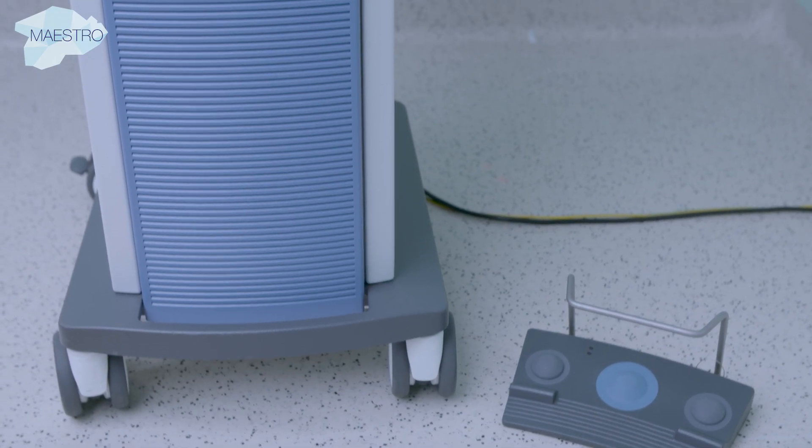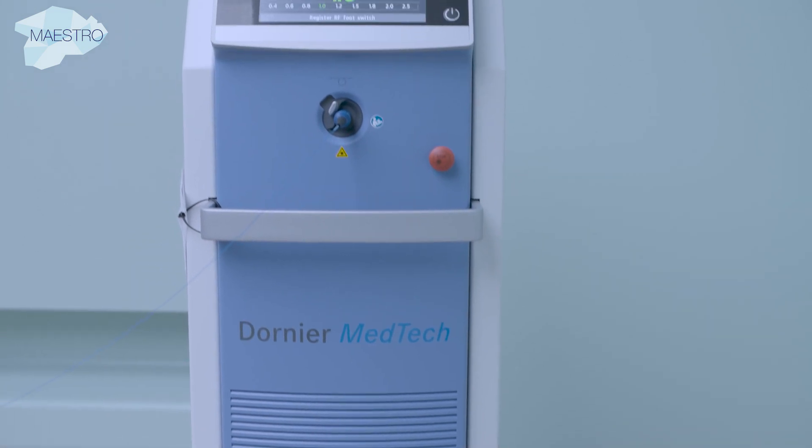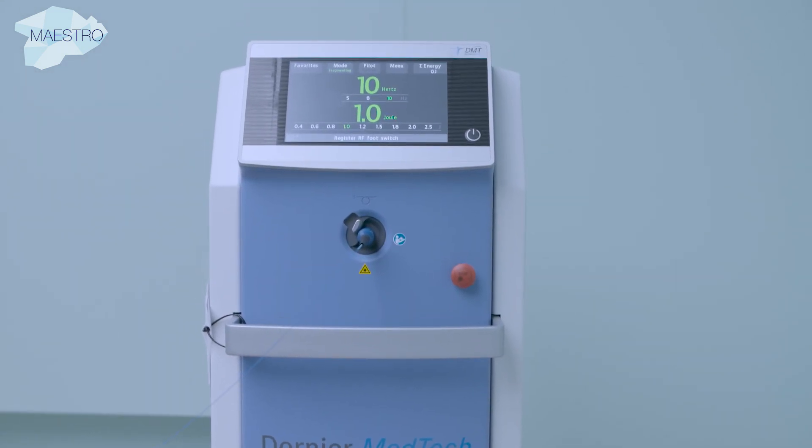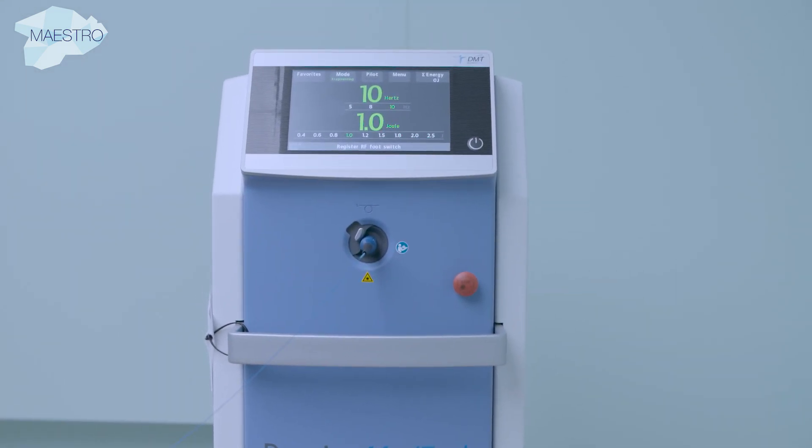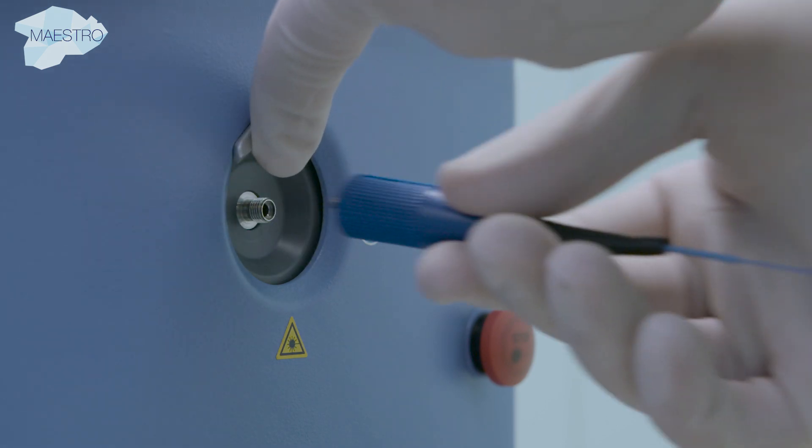The Holmium YAG laser is a solid-state laser made with the rare earth element holmium in combination with a yttrium aluminum garnet crystal. It operates at a wavelength of 2100 nanometers, which falls in the infrared spectrum and is therefore invisible to the human eye.